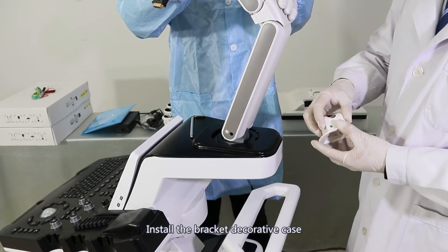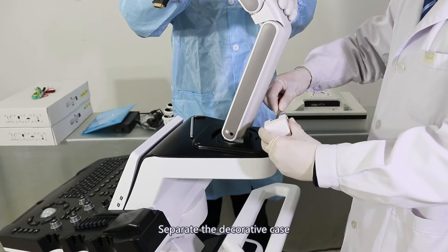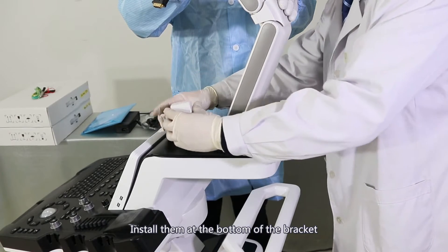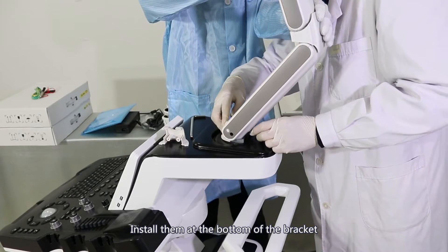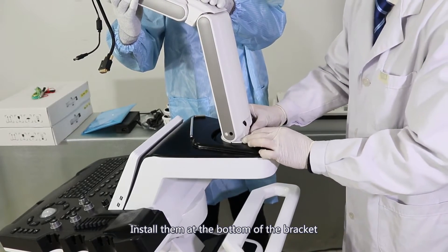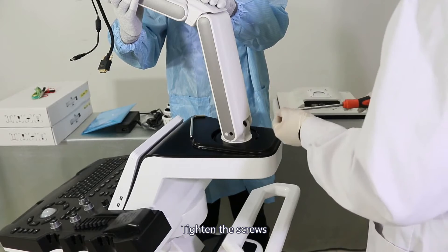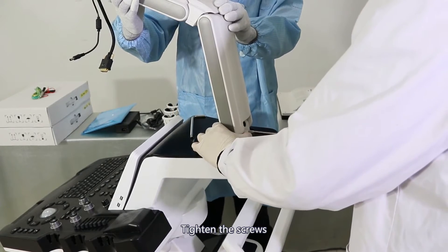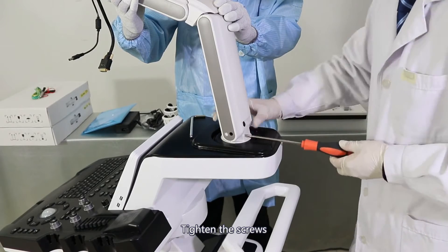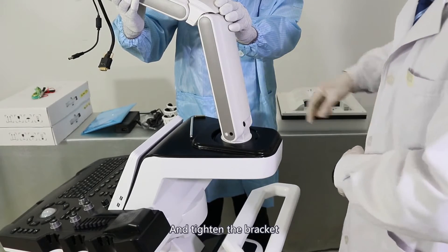Install the bracket decorative case. Separate the decorative case and install them at the bottom of the bracket. Tighten the screws and tighten the bracket securely.